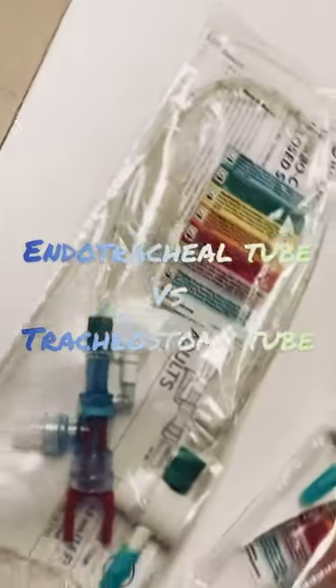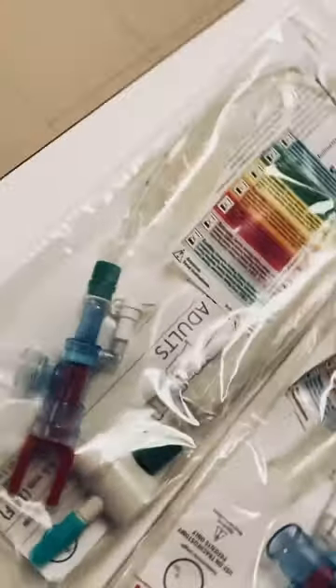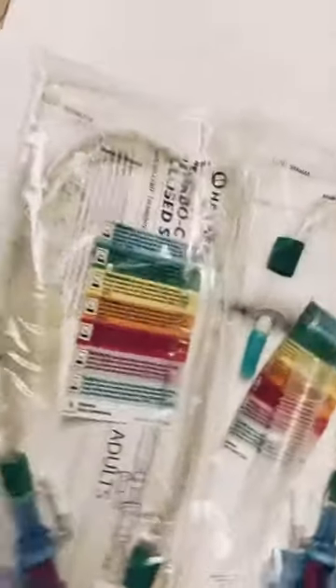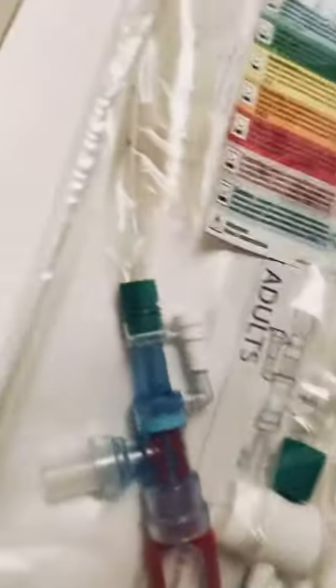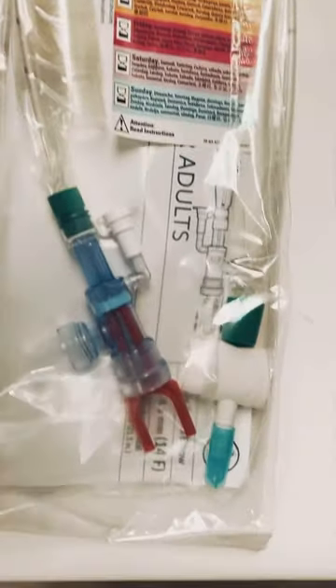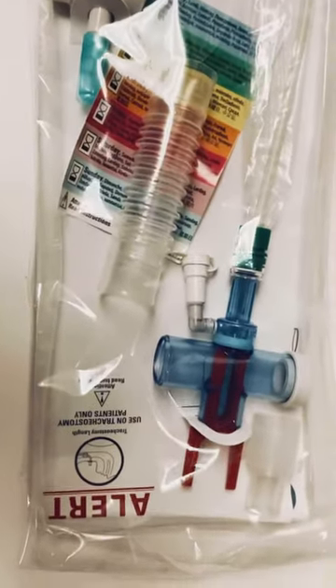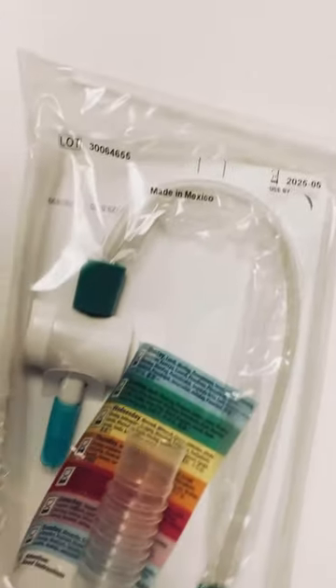Hey respiratory family. These are our two size Ballards that we have. Ballards are suction catheters for our endotracheal tubes and our tracheostomy patients. We have this Ballard for the endotracheal tube — can you tell why it's for the endotracheal tube? This Ballard here is for the tracheostomy tube — can you tell why it's for the tracheostomy tube?